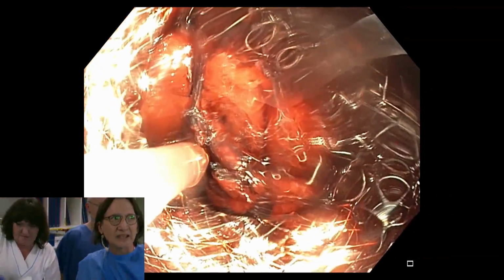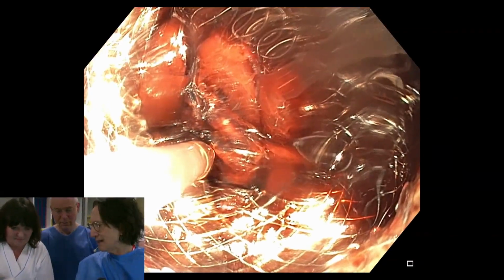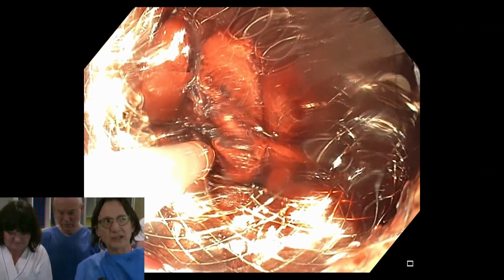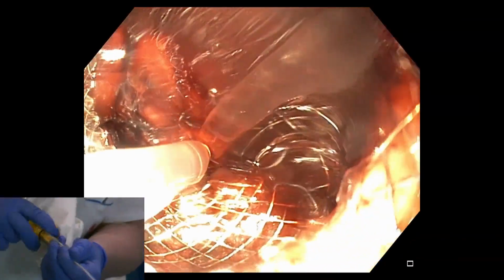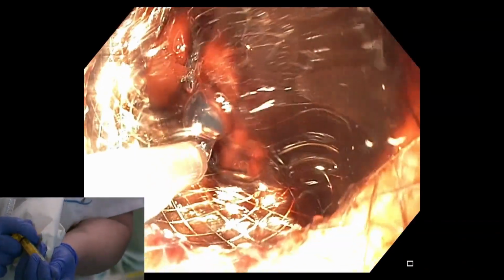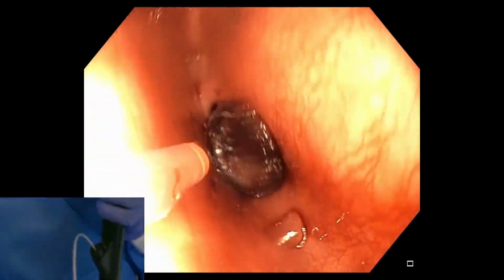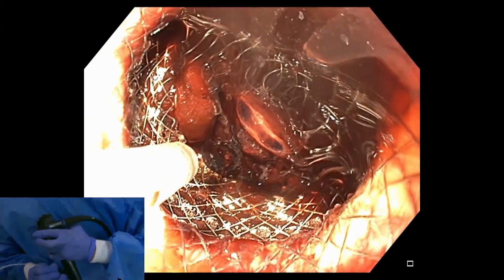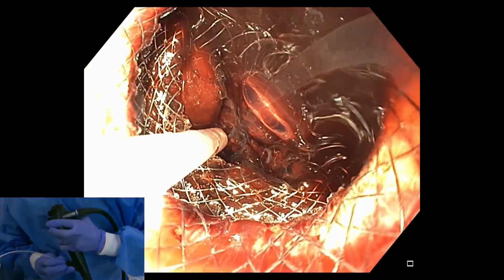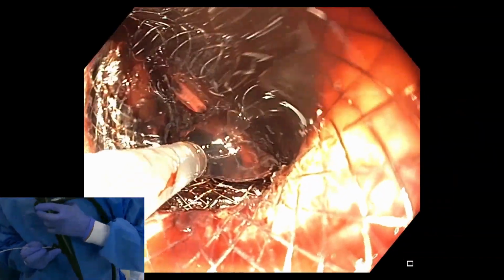So we just have the assistant push out all of the gel. It just drips out. Another syringe full. And she'll let me know when it's all out, and then I just pull out. But I wanted you to see how there we see the remainder, and I just swivel it around. Oh, it just fell off for a moment. Let me just go back in quickly. Pull back. Just get the remainder of the Purostat out. Keep expelling. There it goes. Very nice.